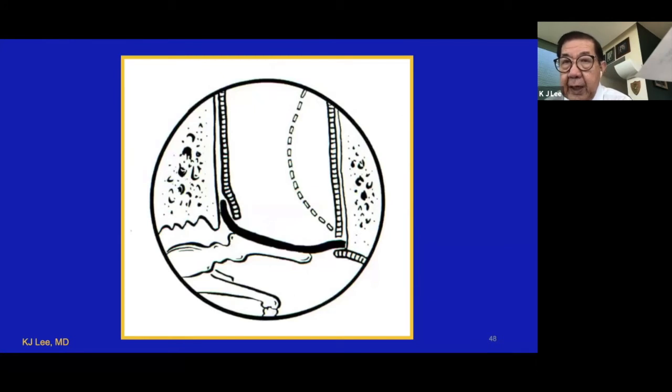Now, this patient has an anterior canal bulge. Another problem in tympanoplasty is what we call delayed conductive hearing loss. And the reason it's delayed is the tympanic graft, which is symbolized by the dark color, migrates laterally. And therefore it loses contact with the malleus or with the incus or whatever.